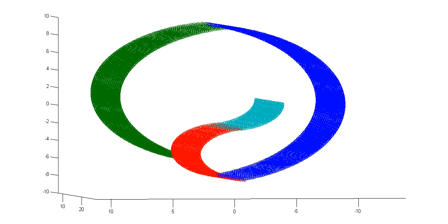And this, in some places, is referred to as mind reading, which is a little generous. But this is a certain style of analysis that people do to show that in this brain region there exists information about, say, the identity of the image that's being shown. I can read it out from this brain region with this classifier that I trained. Importantly, you generally have to train the classifier on an individual person.